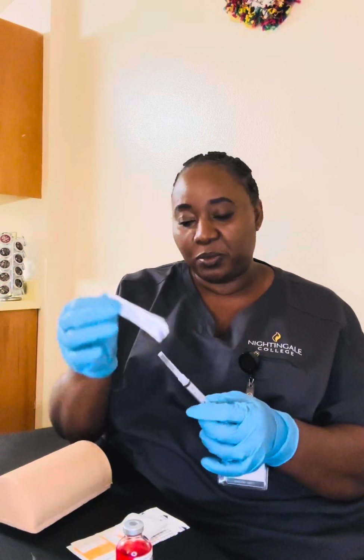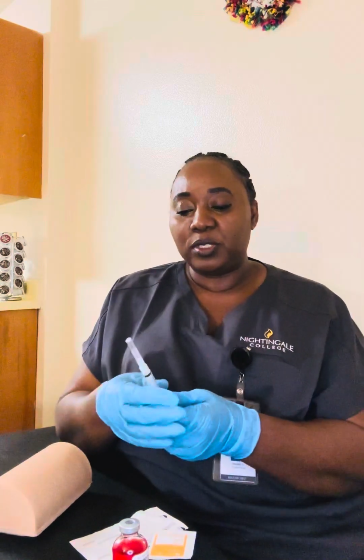I always like to cap the needle before removing it from the strap. Once that is done, I'll place that down, take my alcohol swab, and clean the top of the vial. Once that is clean, I'll first of all make sure it's 1 ml.